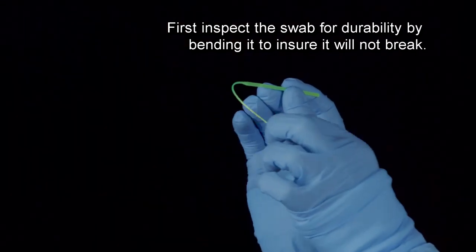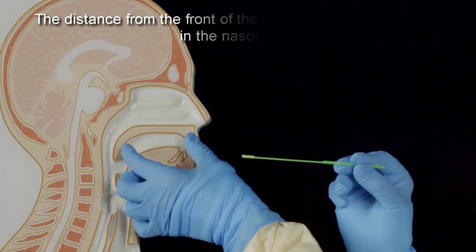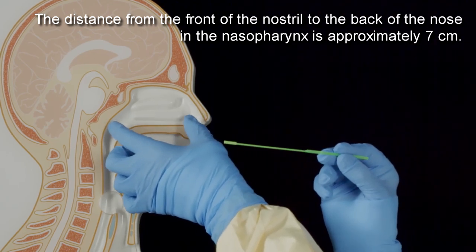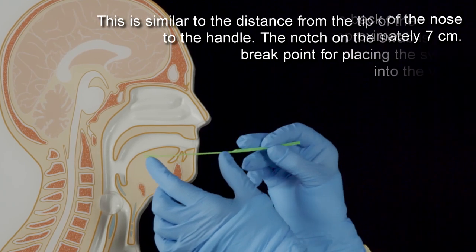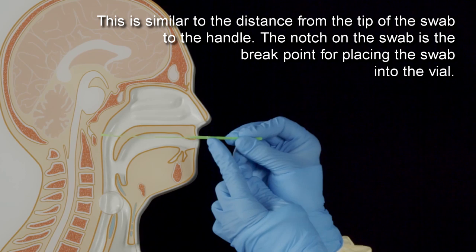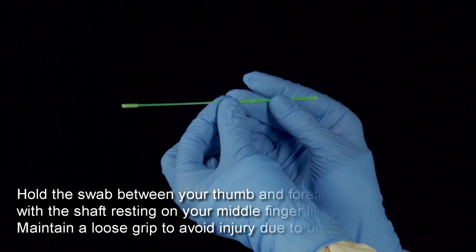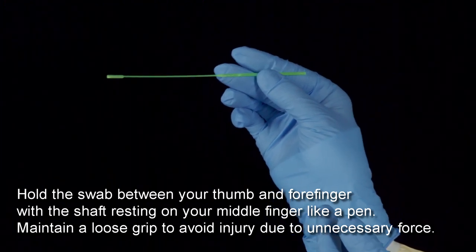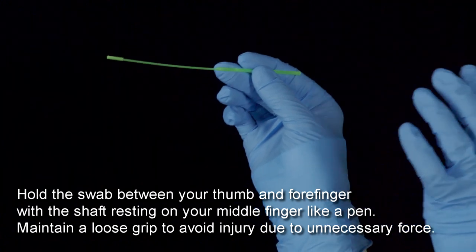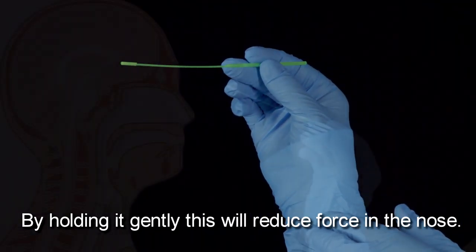First, inspect the swab for durability by bending it to ensure it will not break. The distance from the front of the nostril to the back of the nose and the nasopharynx is approximately seven centimeters, similar to the distance from the tip of the swab to the handle. The notch on the swab is the break point for placing the swab into the vial. Hold the swab between your thumb and forefinger with the shaft resting on your middle finger like a pen, and maintain a loose grip to avoid injury due to unnecessary force.